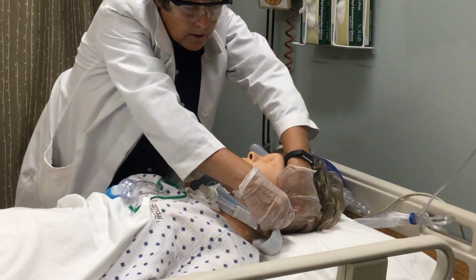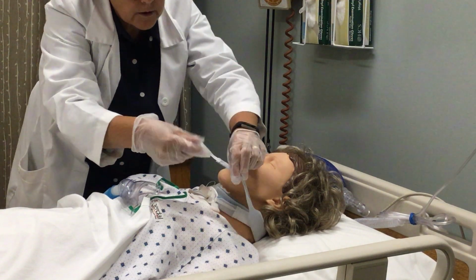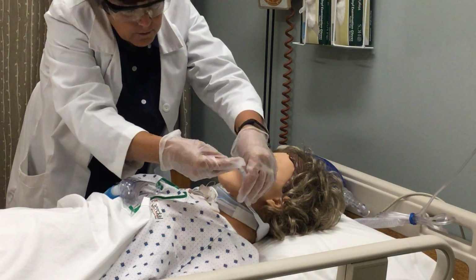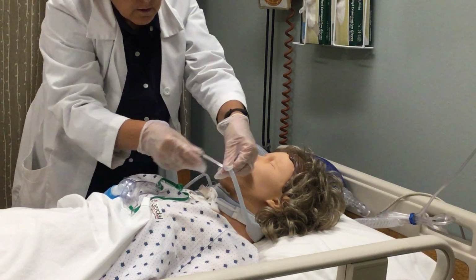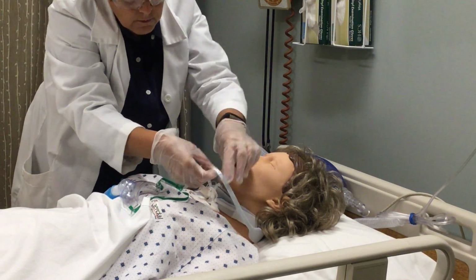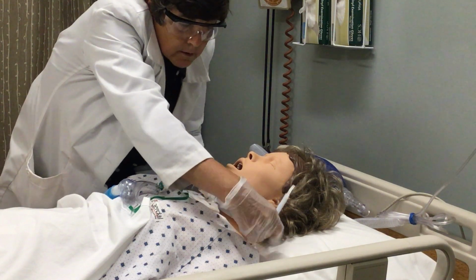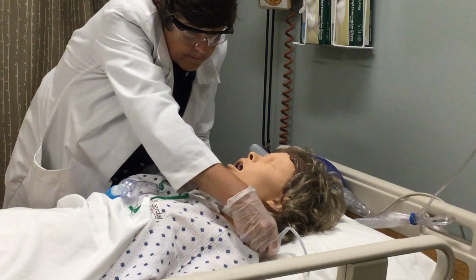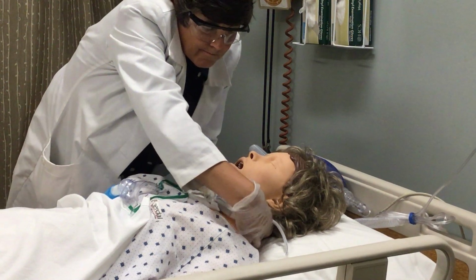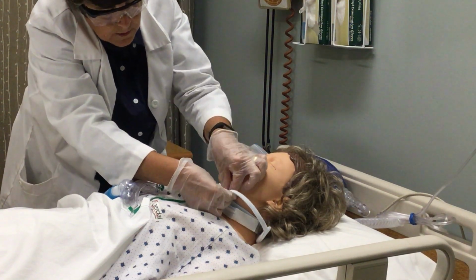This is why we wear goggles in case she coughs. Okay, so what I do is I slip the first strand through. Hang on, Mrs. Cruiser. I think our securing device is all twisted. So pull that up and through.